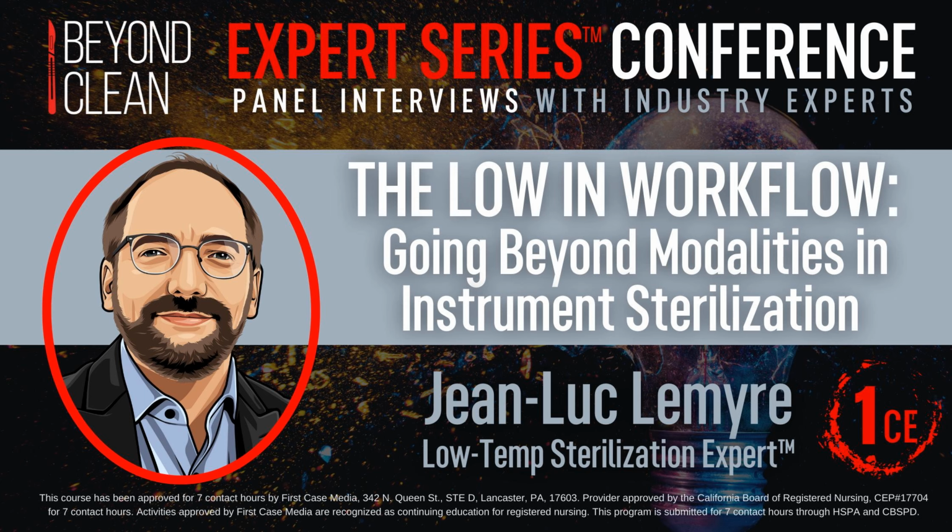Yeah, it's very reactive. You should avoid any contact with, for example, paper or cellulosic material, as it can spontaneously start fires, actually. So that's one of the considerations in the design of the container in the low temp sterilizer, to make sure that there's basically no waste at the end. You want to make sure that everything drawn from the sterilizer goes into the catalyst, and that if your user puts the bottle in a trash can, for example, they're not at risk of starting a fire. Wow, yeah. And I'm jumping ahead of us here, but that just sparked an interesting thought.